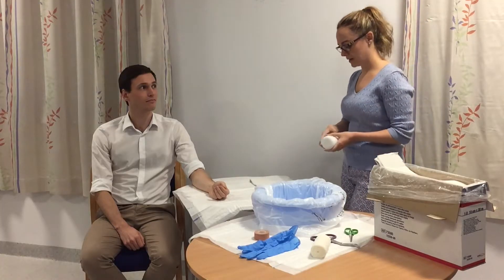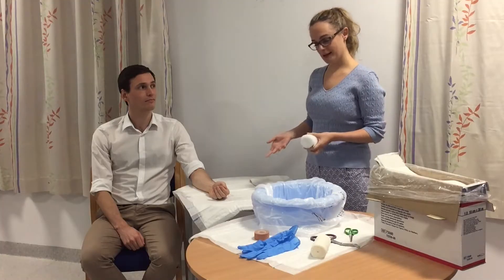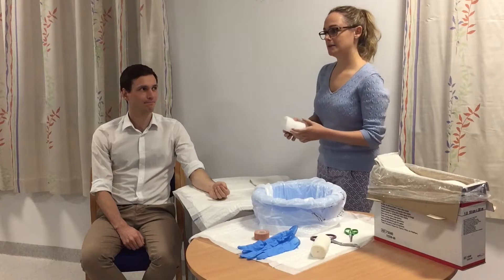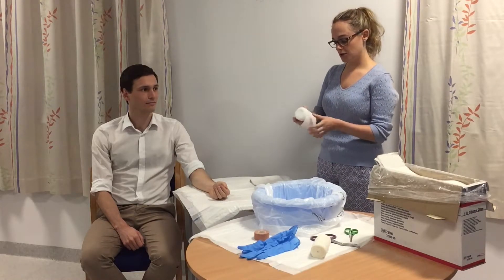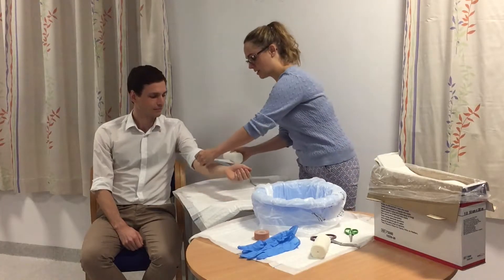Start by putting the wool on, which is really important, because when the plaster hardens it can irritate the skin, and also because as the plaster dries it heats up — you should feel warm, that's normal, it's an exothermic reaction. So it's really important to put this on. A tip: it should roll off, so wrap it around the arm this way — it's much easier to wrap rather than going from inside out.